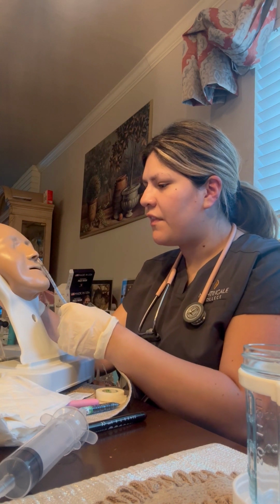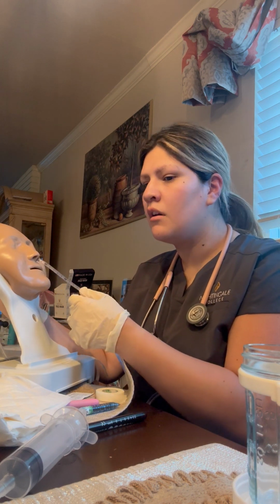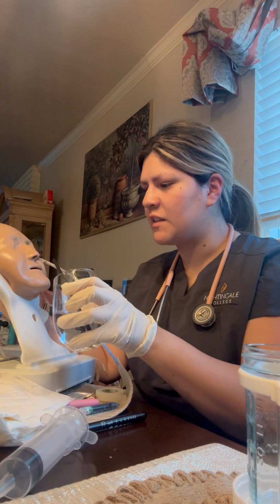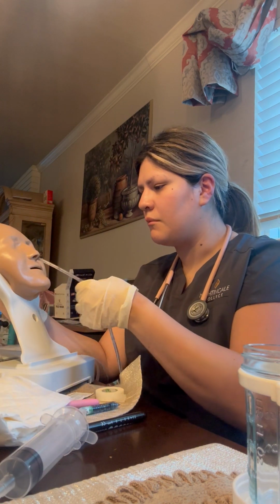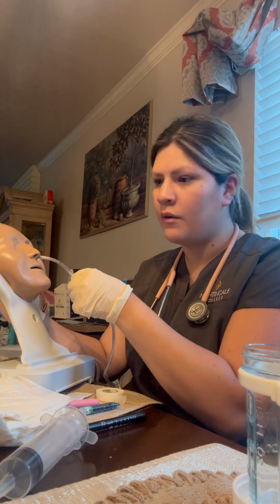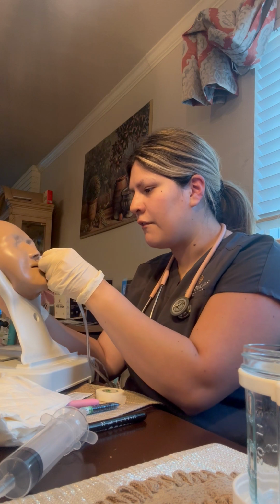And at this point, if they were gagging or they were having trouble, I would have them just try and swallow. I would even offer water at this point just to kind of help them. Of course, we're not met with any resistance. If we were, we would take the tube out and re-lubricate it and retry. So here we are about 50.